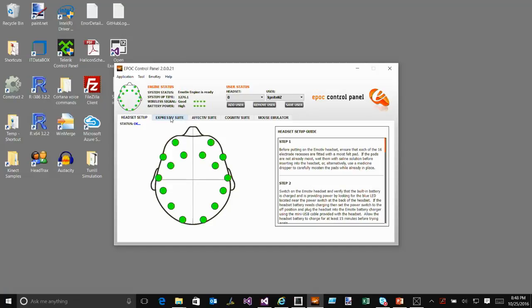You need a wet connection to actually pick up that electrical activity. So when I got here way early to get set up, I just used regular saline solution, the same thing I use for my contact lenses, which makes traveling easy. And then I put a little bit on each one of the sensors before I screwed it in.